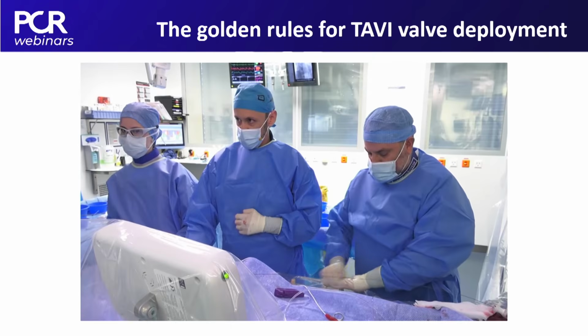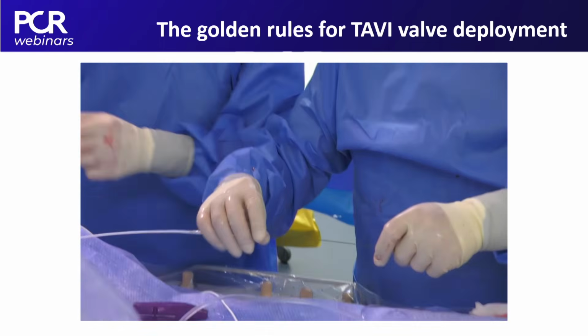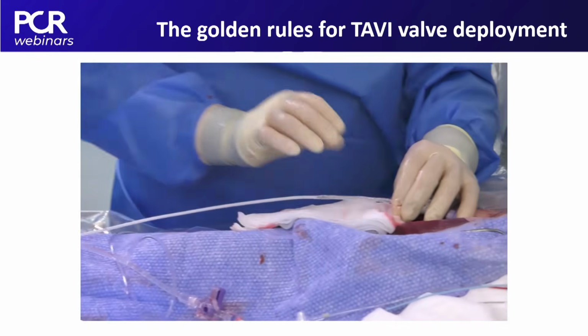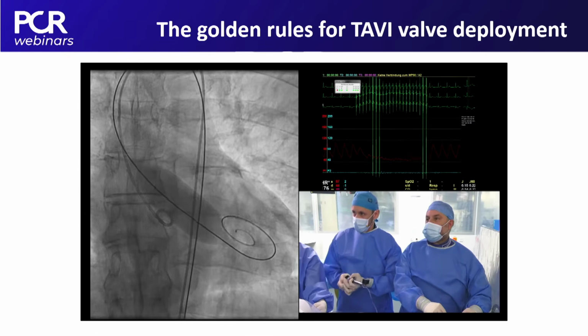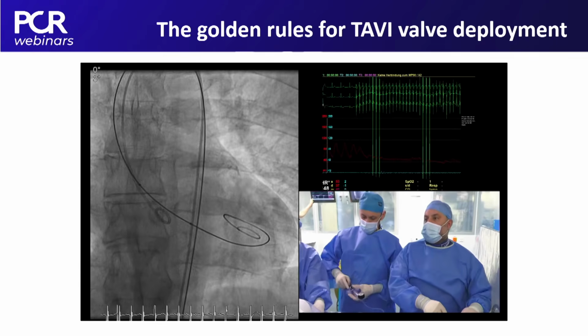I think now we are ready for the balloon predilatation. We are going to use a 22 millimeter balloon. The nominal diameter of the valve is 23, it is quite round. Pacing on. Stop pacing. Now we are ready.